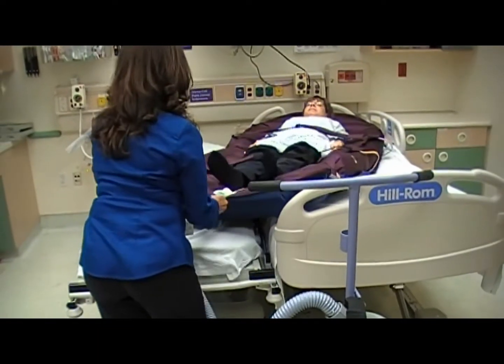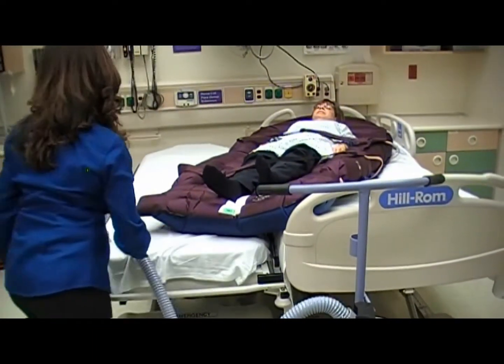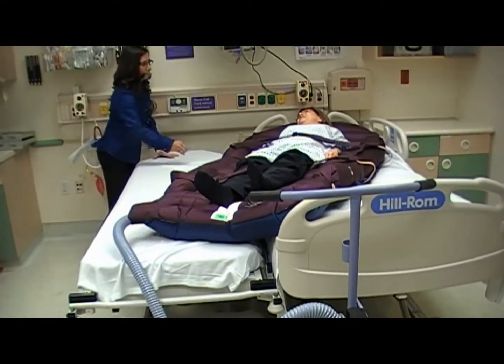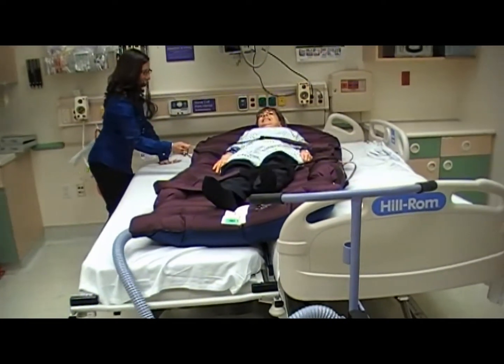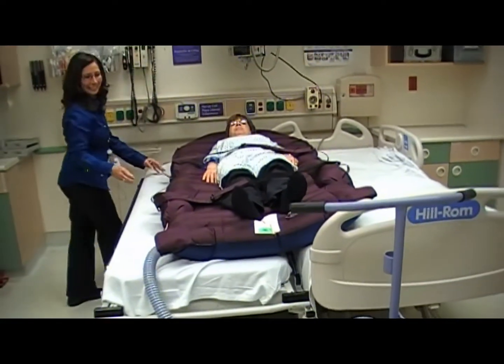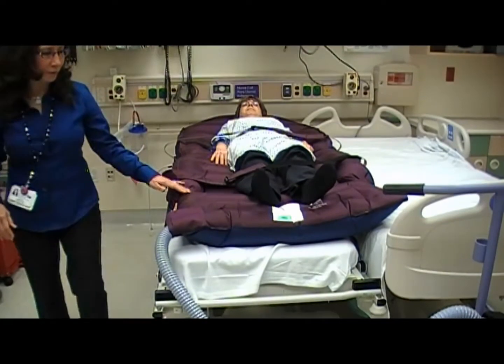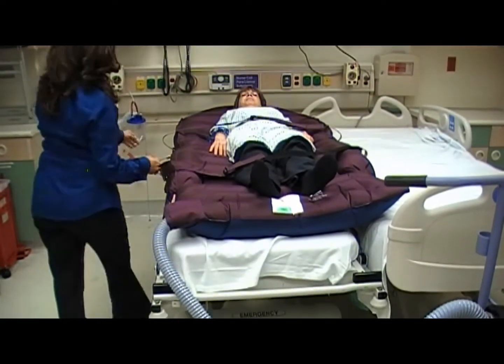When the mat is fully inflated, grasp the handles. If working alone, pull the foot section first, then transfer the head section. Be sure to use the handles and do not use the restraining straps to transfer the patient. Make sure patient is well centered on the gurney.